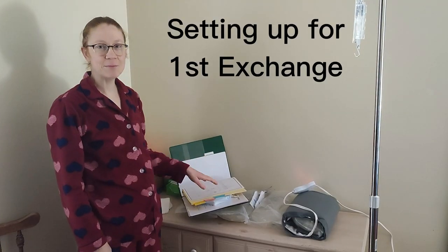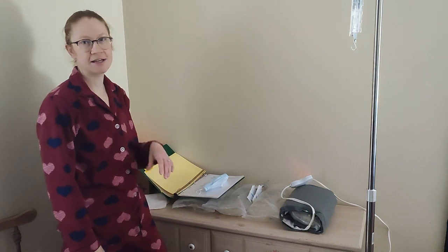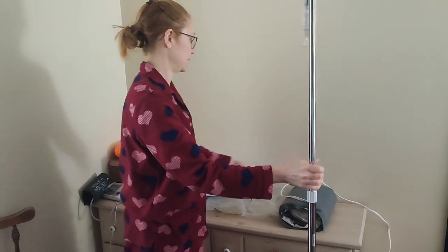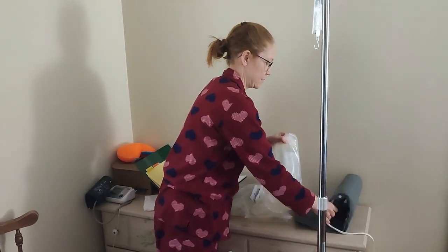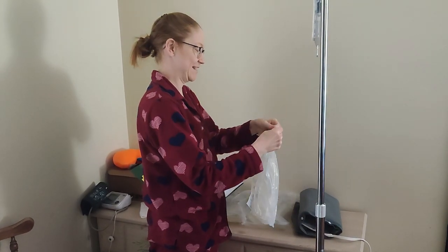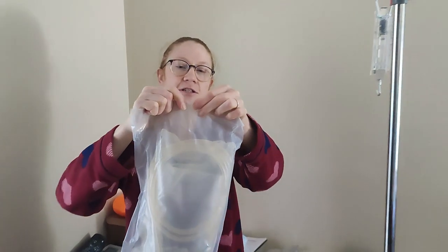I've written down my blood pressure and my weight, so now I'm ready to start therapy. The first thing is I've got to get everything set up on my IV pole. I've got my bag all heated up and it feels a little bit warmer — that's good. I need to get it open; it's got a little notch in there that's actually going to help me open it because it's not very strong.